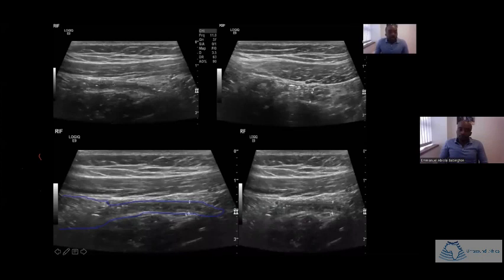It's a bit small too, but when normal, it can be that small and that tricky to see. I'm literally just saying about 50% of normal appendices are not visualized on ultrasound. In many cases, it can be a bit tricky to see the normal appendix, but it doesn't mean we shouldn't try.